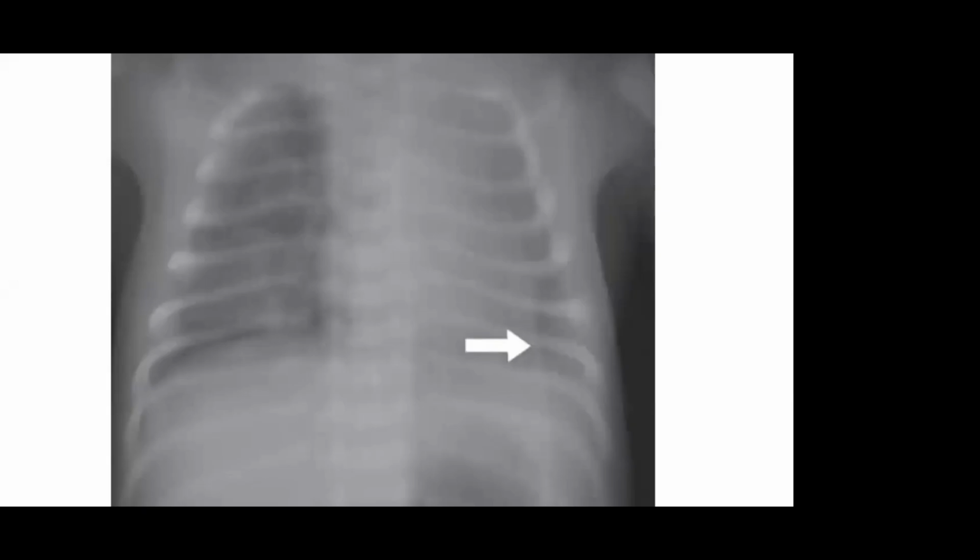So whatever X-ray you are seeing, see what is being shown in that X-ray. Okay, what is this? Please make it fast. We don't want to do breakfast with each other.